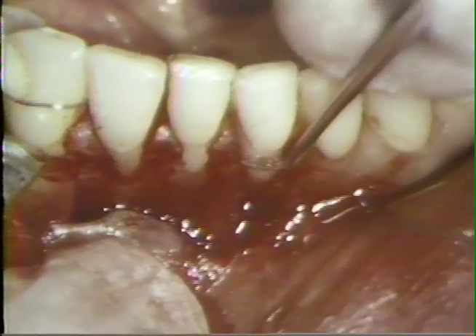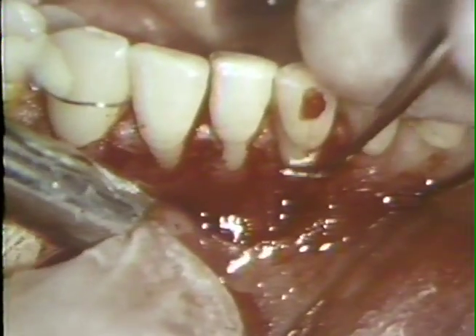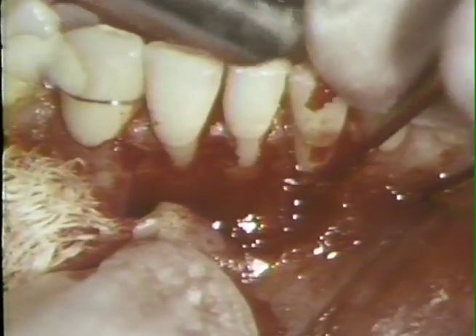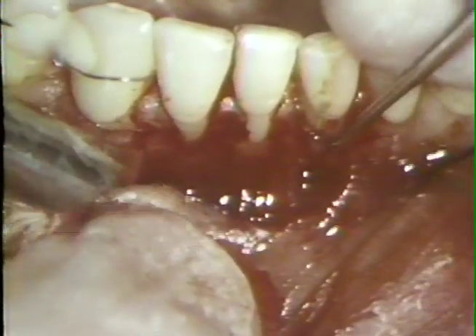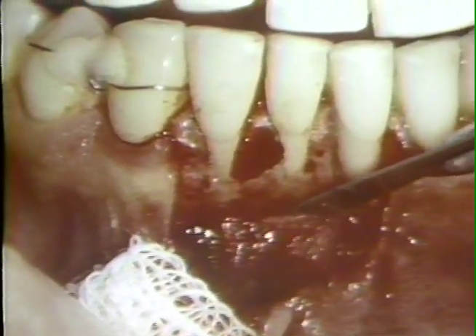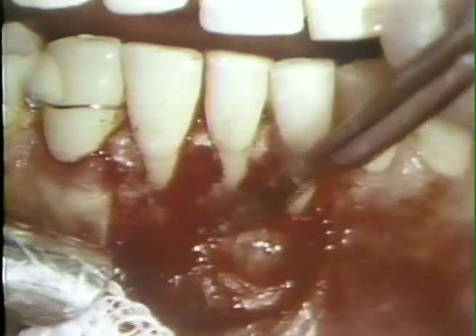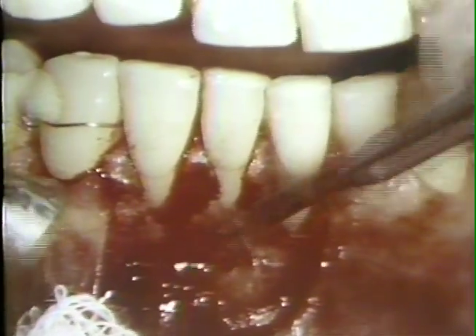Prior to positioning the flap, the root surface is lightly planed to remove any remaining necrotic cementum and debris. A Goldman Fox number 12 instrument is used. The mentalis muscle fibers are relieved by sharp dissection from their attachments to the periosteum. The attachment of muscle fibers is thereby relocated to a more apical position.